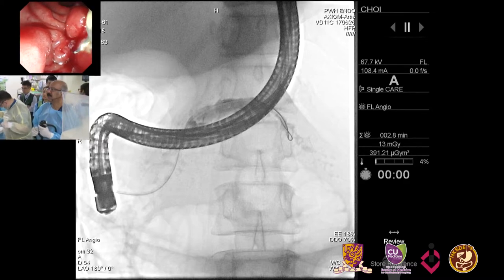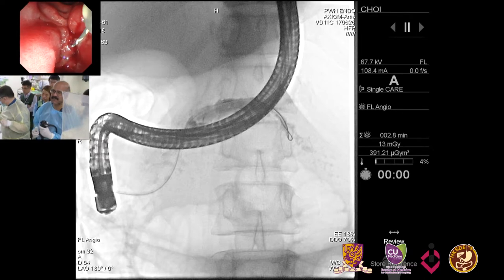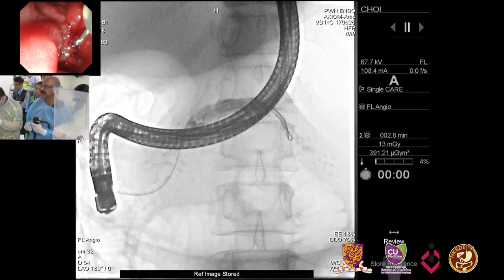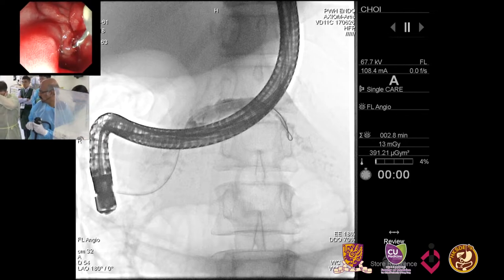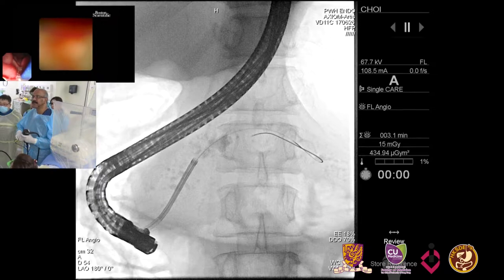No. Sphincterotomy has already been done, so I'm not using dilation, but I'm not sure about the internal anatomy. So what I'll do is after putting the Spy scope, I'll see if there's a stricture there, then we have to come back and dilate the stricture before going in. I have a feeling that this may be a little difficult in the head region, but once you get just past the head, if you visualize the big stone, then we can do the laser. Yes, we can. We have the scope right up to the stone there.